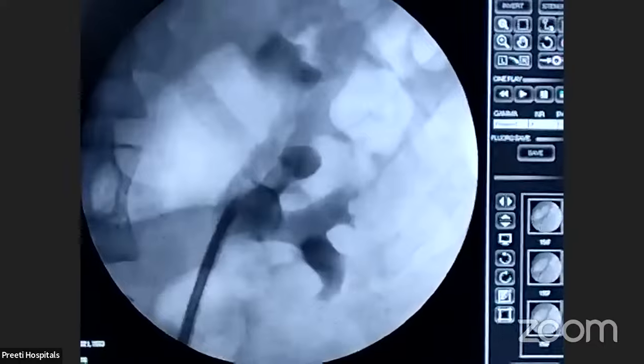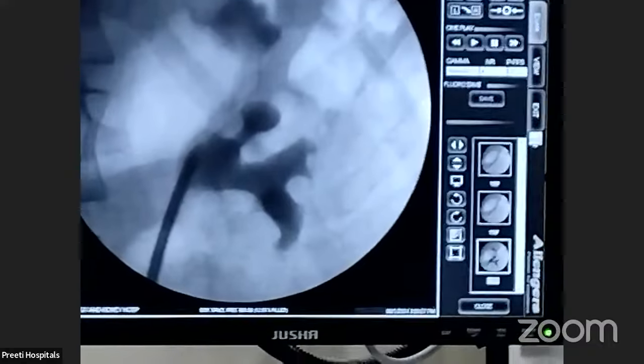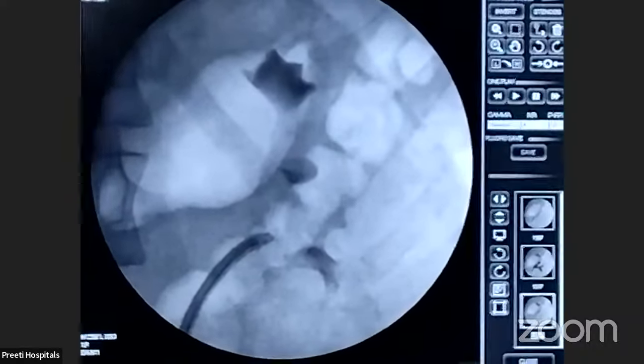See, can you see? All upper calyx, everything. Now see how we can suck it out. It is extra radiation. I am sorry. For academic purposes, I am extremely sorry for that. For the staff also. Suck it out. See how it is sucking in seconds. Can you see, seconds?